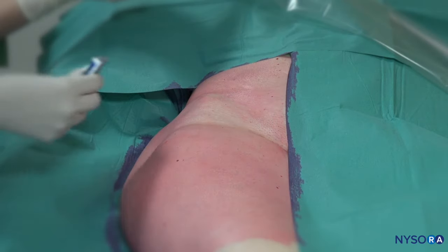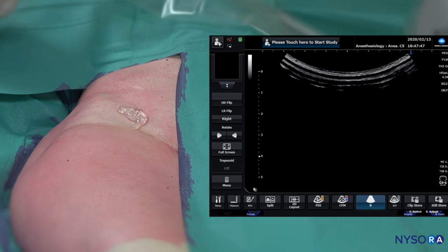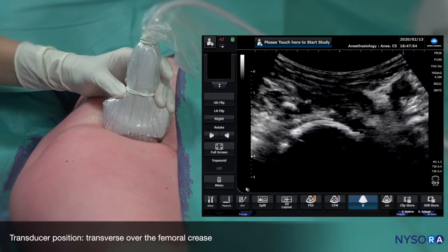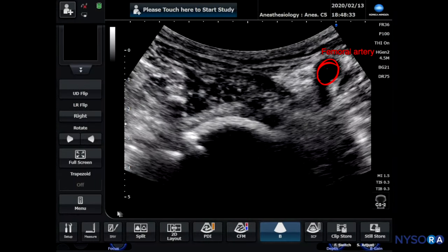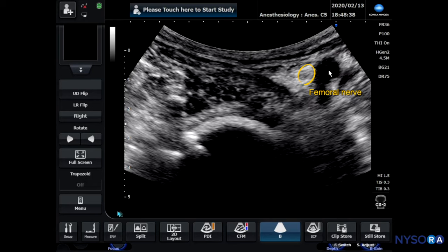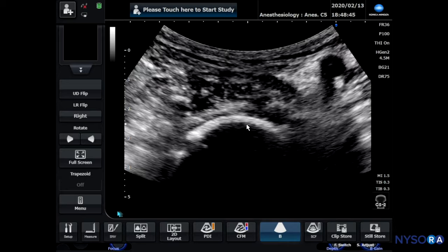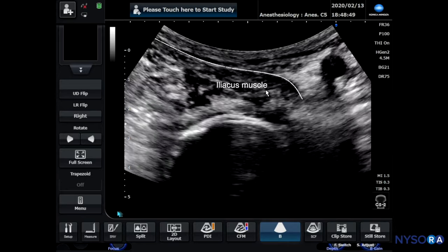We're going to position the transducer on the femoral crease with an intention to localize the femoral artery and the femoral nerve. The ultrasound is now positioned to 5 centimeter depth. Here we can more clearly see the femoral artery, the femoral nerve, and here we can see the hip joint or hip capsule. This is the iliacus muscle and the fascia iliacus here as well.